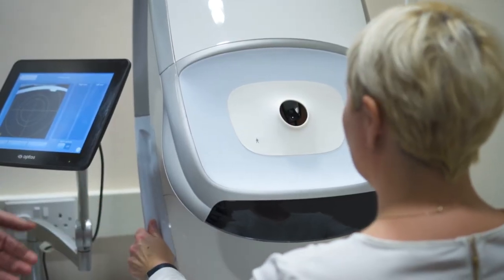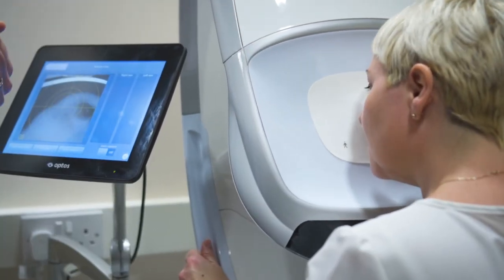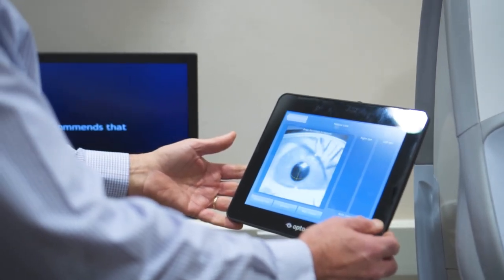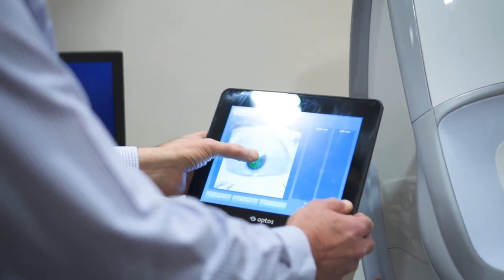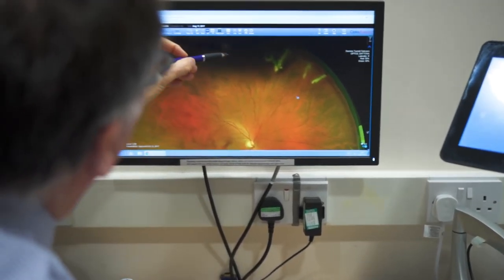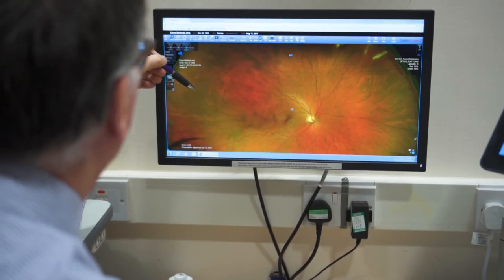From a patient point of view, using this machine could not be more simple. All you have to do is lean forwards, pop your eye against a small aperture, and look at a target. The operator will then ask you to look at the target and will trigger the machine to take three images for each eye — and that's it. We don't have to wait for the results; they're projected straight through to the monitor and we can spend a couple of minutes talking you through them right there and then.